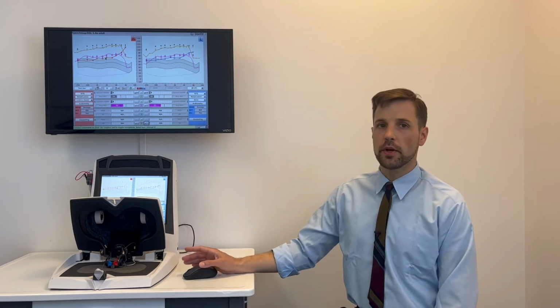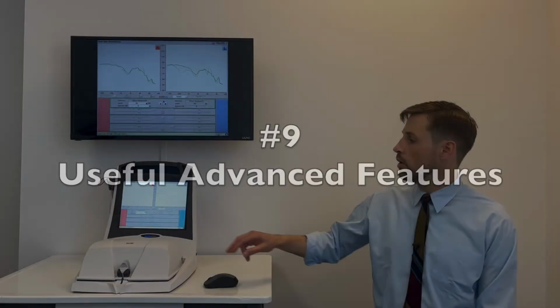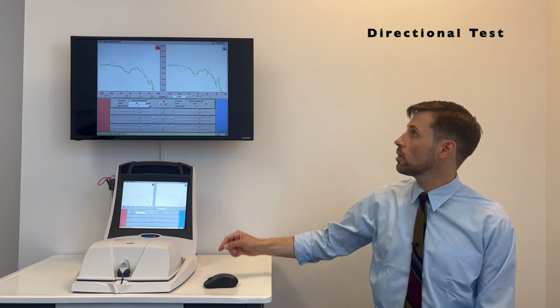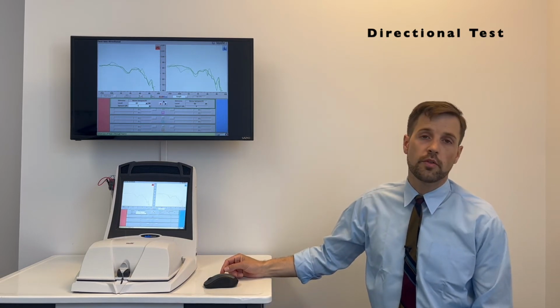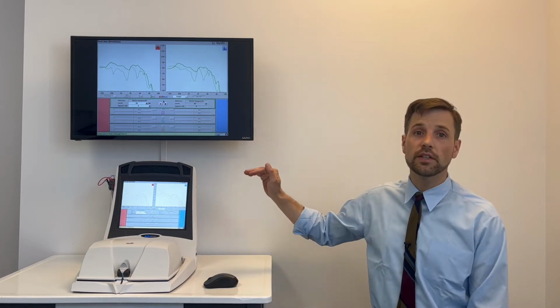I've tested this out a bunch, and there is a venting correction for open fittings as well. The open fitting in the test box, to me, is not quite an open fitting in the ear, and we know that everyone has different ear canal resonances and acoustics, but at least it's trying its best to account for that now. So I got a set of hearing aids in the box right here, and the dark curve is the curve for the response from the front microphones, and the light curve is the response from the back microphones, and you can start to see that really separating now.